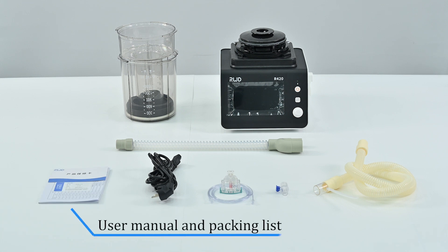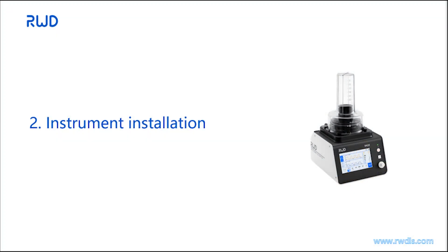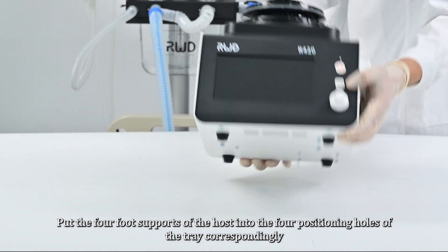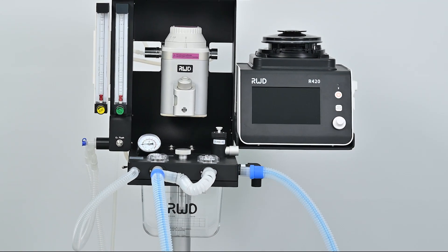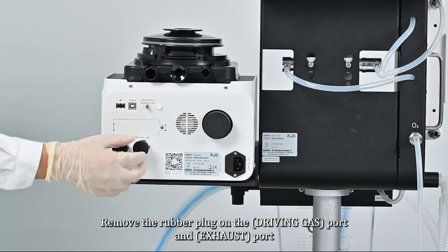Also included are the user manual and packing list. Put the four foot supports of the host into the four positioning holes of the tray correspondingly. Then remove the rubber plug on the driving gas port and exhaust port.